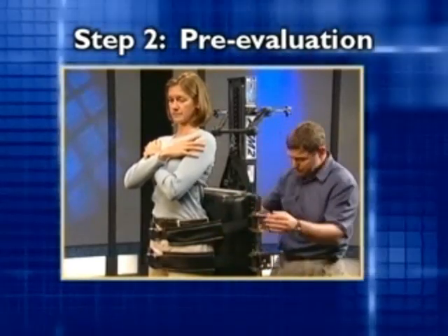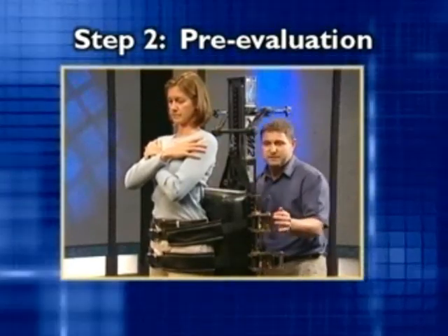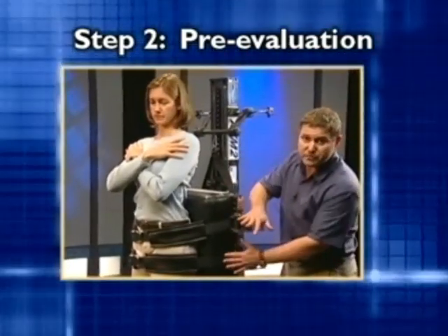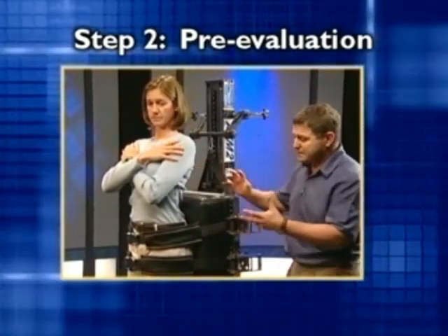Patients should be encouraged to find their own pain-free position as they feel the differences with each adjustment. The pre-evaluation provides the clinician with a unique ability to ensure that the movement will be pain-free, even before performing the active clinical intervention that follows.